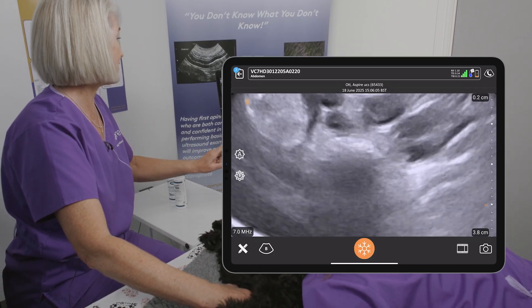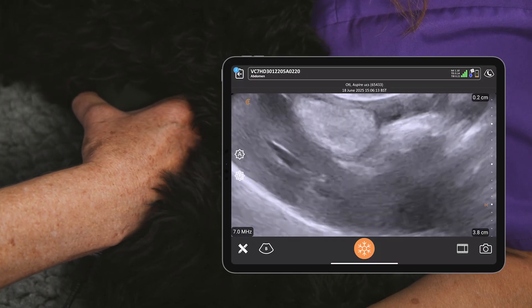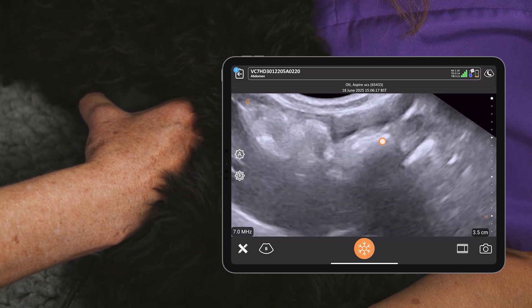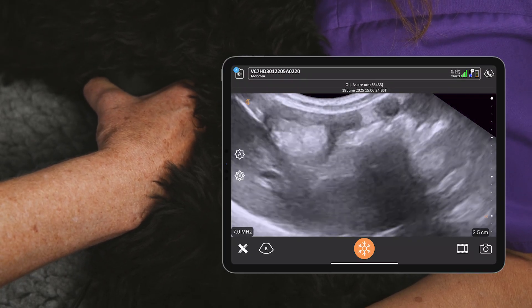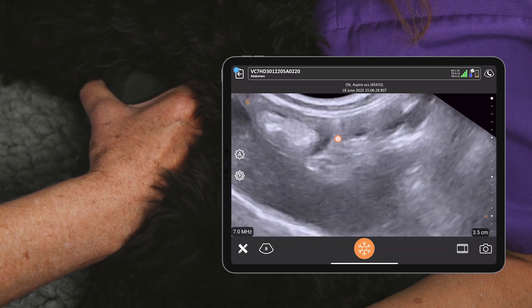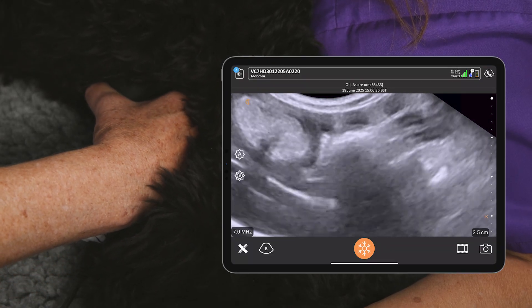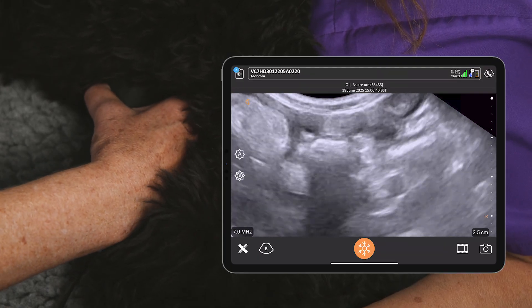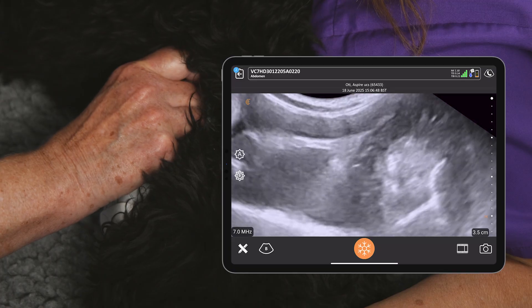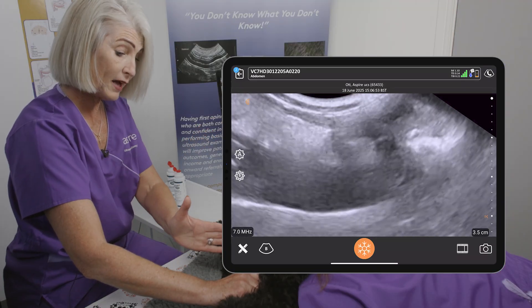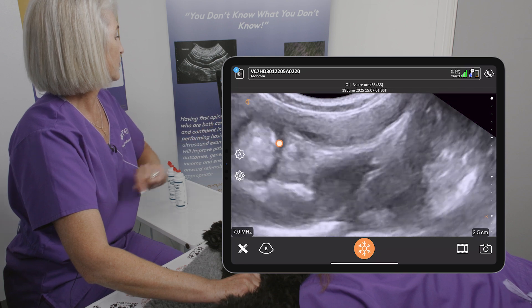We've only got a thin section of it here, so I want to scan across the midline and make sure there are no big masses anywhere. You often need to press in a little bit — here's our colon, there's our caudal margin of the stomach, and the pancreas is going to be in this area here. The left limb of the pancreas in a dog is not quite so easy to see as the right limb. In a cat it's the opposite — the left limb is the easier one to see. Once you've located it, you can rotate on it and attempt to find it in a long axis of the pancreas but short axis of the dog.